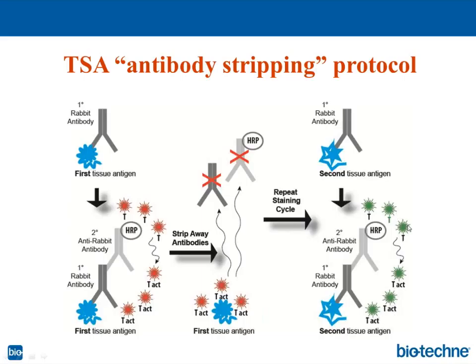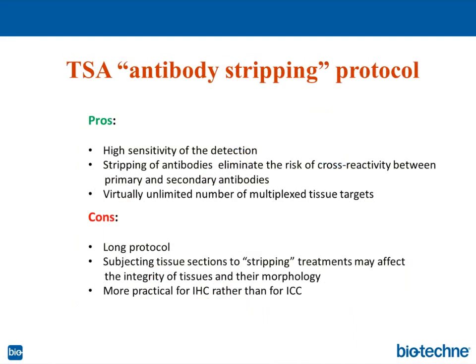And we can repeat it another round and with a different dye. And in the end, we will get several different colors. And again, we use here antibodies raised in the same host species. That's briefly how this reaction works. There are pros and cons in using the TSA antibody stripping protocol.